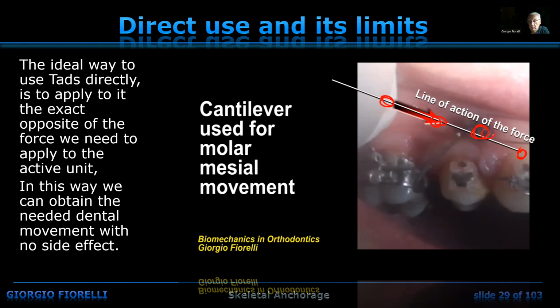So, of course, you will choose one point which is not too high, so that it is covered by gingiva and not by mucosa. And so along this line, I would choose somewhere here. And now, it's a matter of using the right activation of this wire to produce the correct line of force.